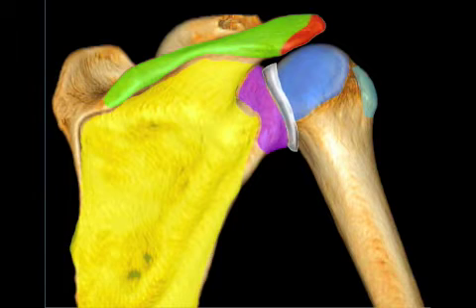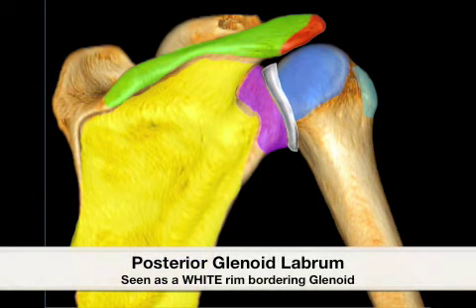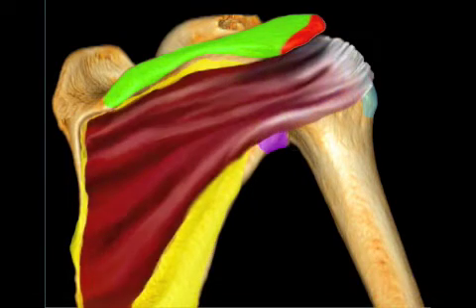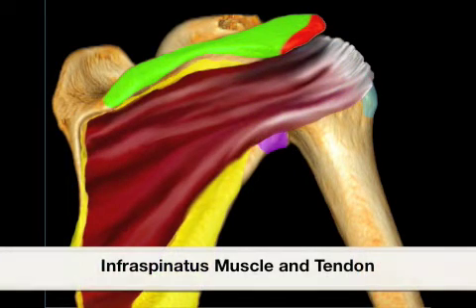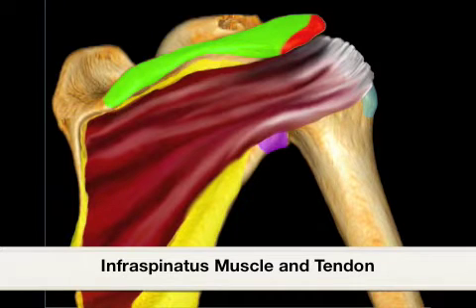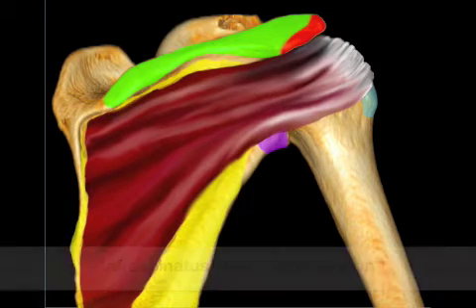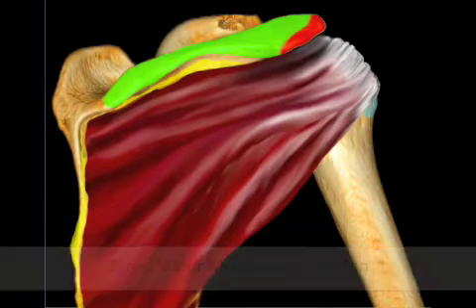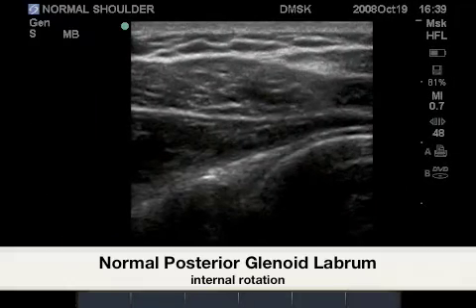The structure in white represents the posterior glenoid labrum, which is only clearly identified by ultrasound at its approximate 9 o'clock position. Overlying these structures is the large infraspinatus muscle and tendon, followed by the teres minor resting just inferior to the infraspinatus tendon.